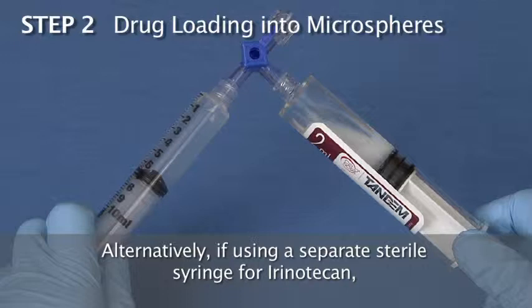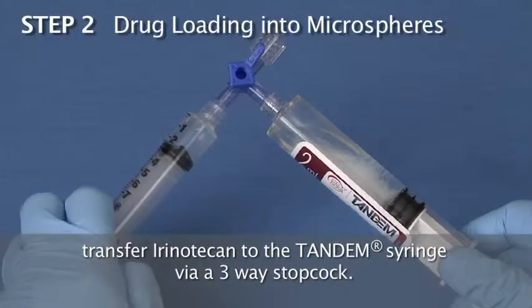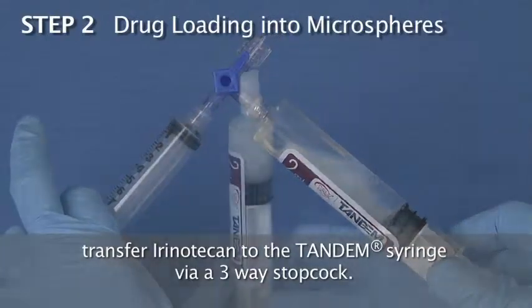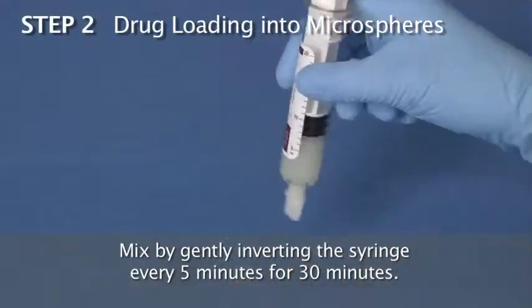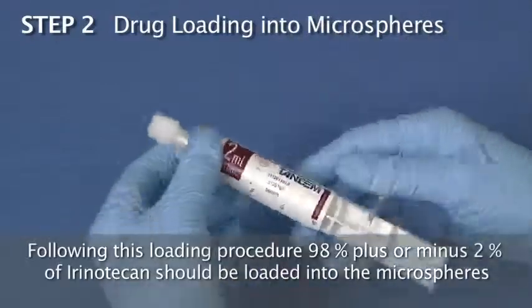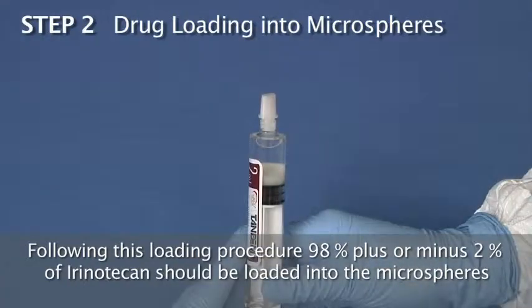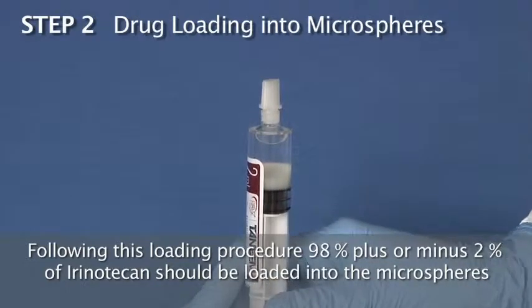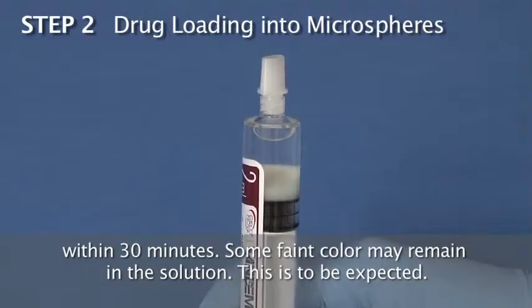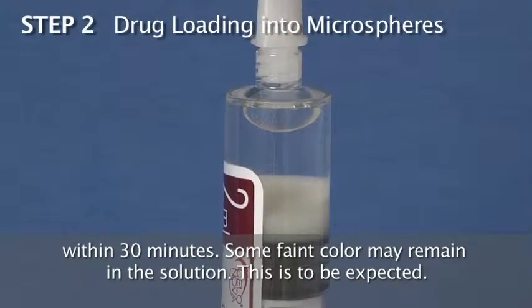Alternatively, if using a separate sterile syringe for Irinotecan, transfer Irinotecan to the tandem syringe via a 3-way stopcock. Mix by gently inverting the syringe every 5 minutes for 30 minutes. Following this loading procedure, 98% plus or minus 2% of Irinotecan should be loaded into the microspheres within 30 minutes. Some faint color may remain in the solution. This is to be expected.